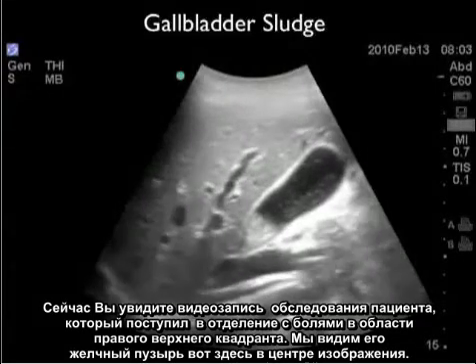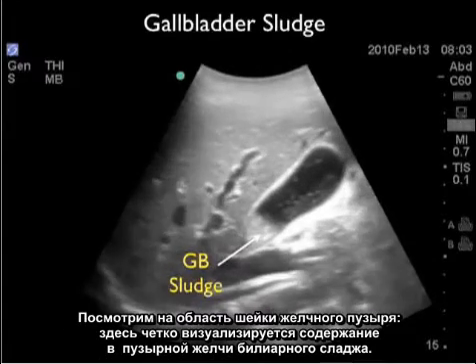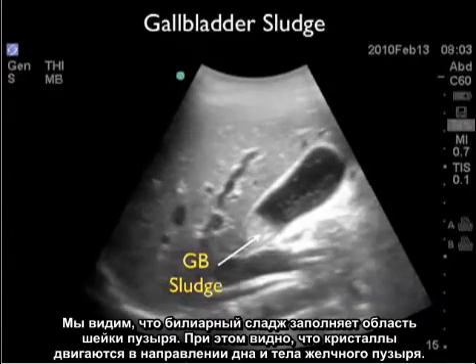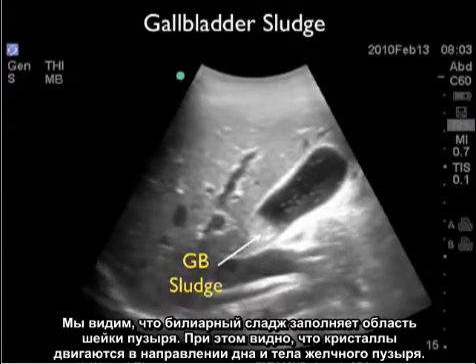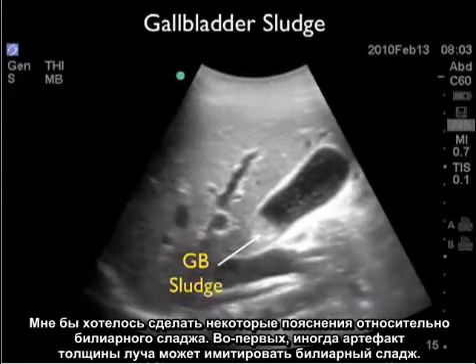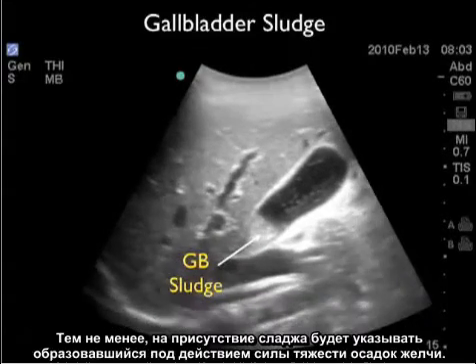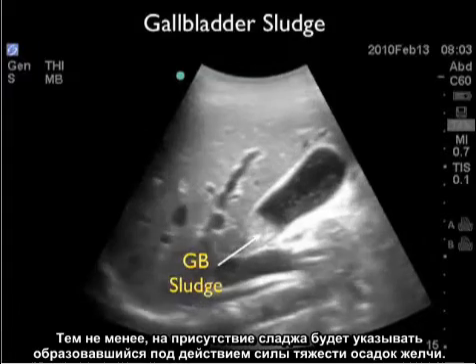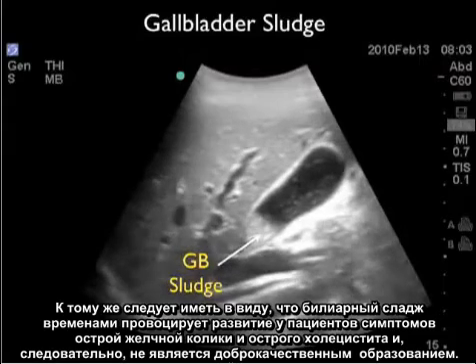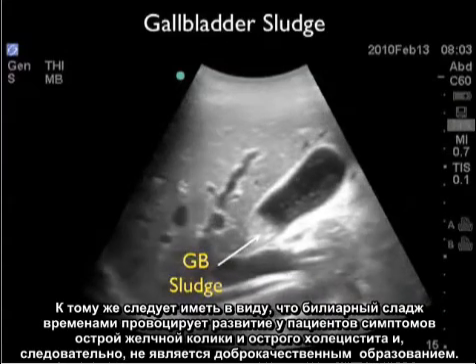Here's a video clip from a patient who presented with right upper quadrant pain. We see the gallbladder in the middle of the image. Looking towards the neck of the gallbladder, we appreciate a fluid level made up of gallbladder sludge tucked in there towards the neck, with crystals moving up towards the fundus and body. Sludge is defined as having a fluid level that layers out with gravity. Also remember that gallbladder sludge can occasionally cause symptoms of acute biliary colic and acute cholecystitis, so it's not a benign finding.